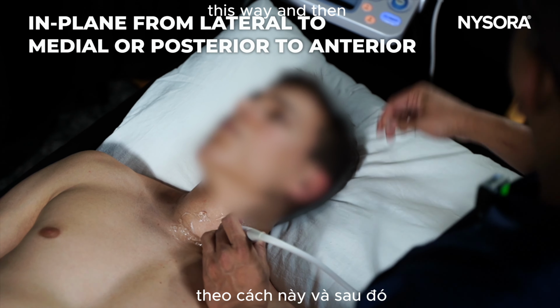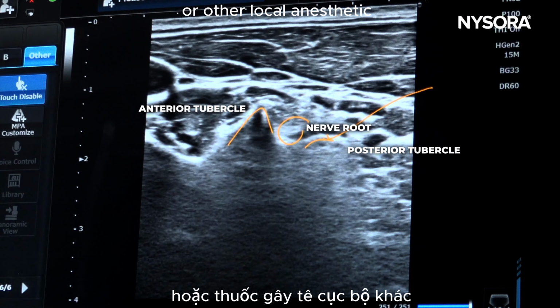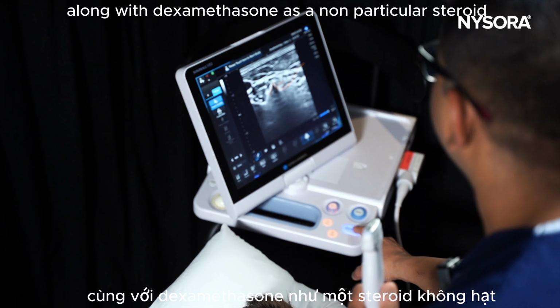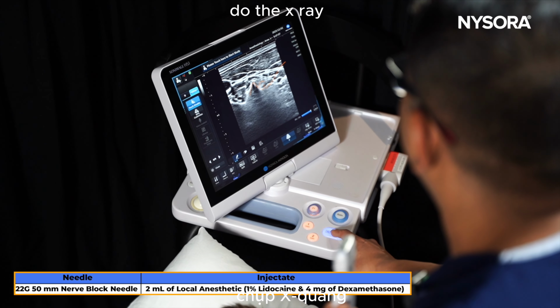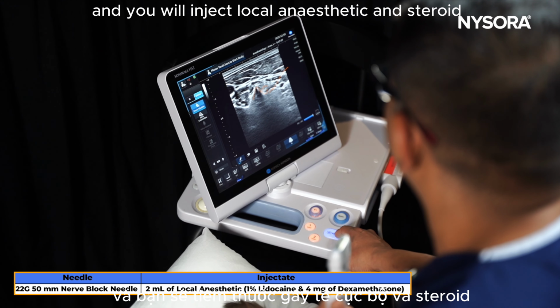and once the needle is at the level of the posterior tubercle, you will inject about 1 cc of 1% lidocaine or other local anesthetic along with dexamethasone as a non-particulate steroid. Before that, I would always recommend using a contrast dye. Do the x-ray to make sure that the needle tip is not in the vessel, and then you will inject local anesthetic and steroid. Thank you.